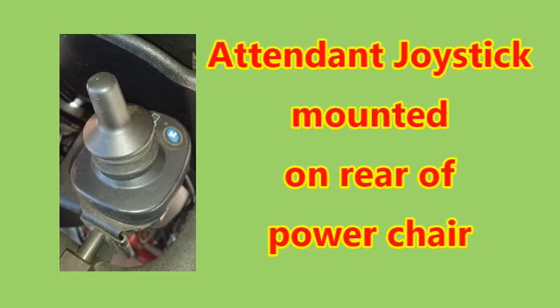Many power chair manufacturers also offer an attendant joystick mounted at the rear of the power chair, which is a convenient way for a spouse or caregiver to move the chair either while you are sitting in it or if they need to reposition it for you when you are not sitting in the chair.